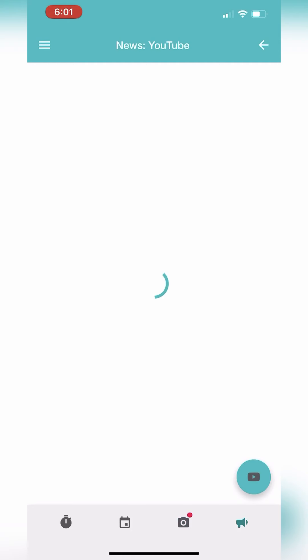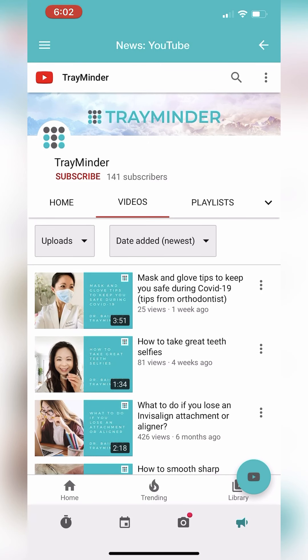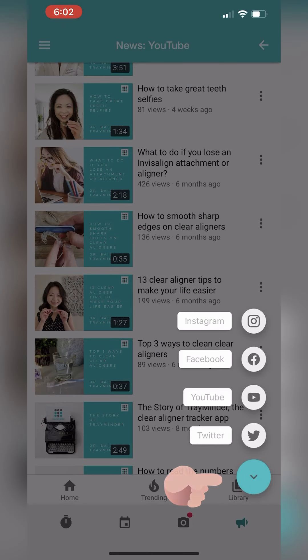The last tab is the news part of the app. It connects you to TrayMinder's social media sites and gives you news on app updates, helpful tips for clear aligner users such as how to properly remove your trays, how to clean them, etc. Tap on the circle button on the bottom right to switch between YouTube, Instagram, Facebook, and Twitter.